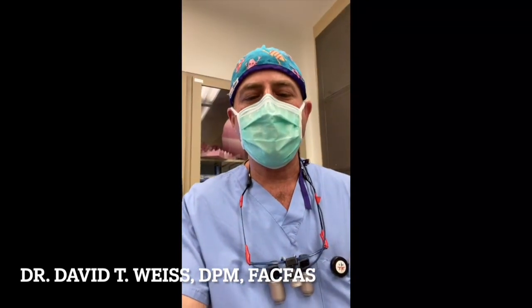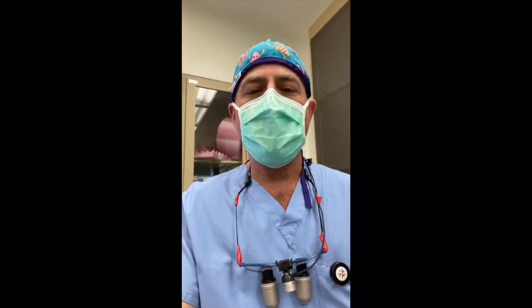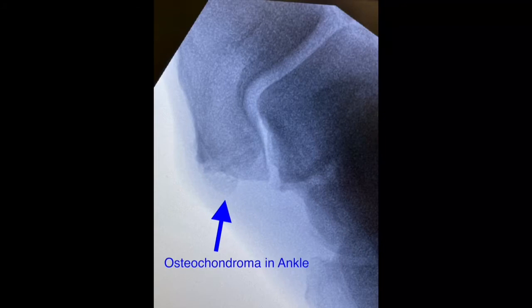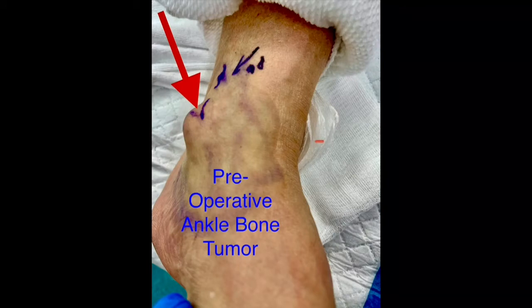Hi, this is Dr. David Weiss. Today we're in the operating room taking care of a painful osteochondroma in the ankle joint. This gentleman has had pain for several years and it's getting worse, and we're removing the bone lesion today, hopefully to never come back. I will show some pictures of the surgery and afterwards, as well as the recovery.